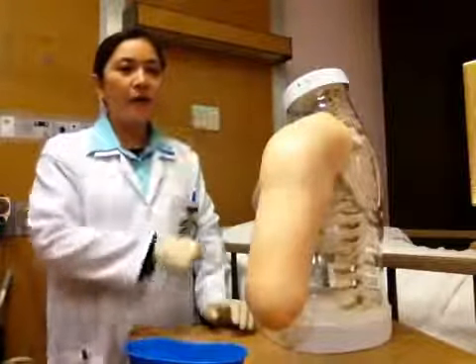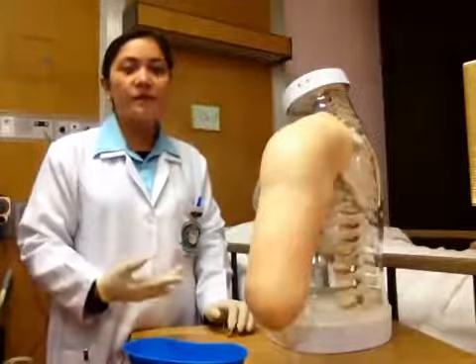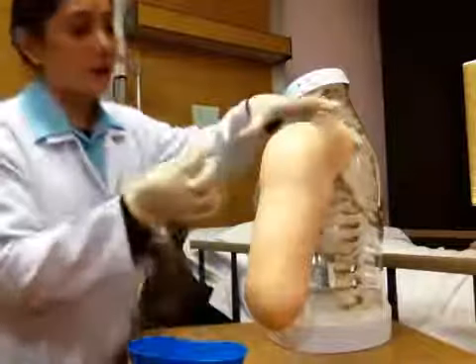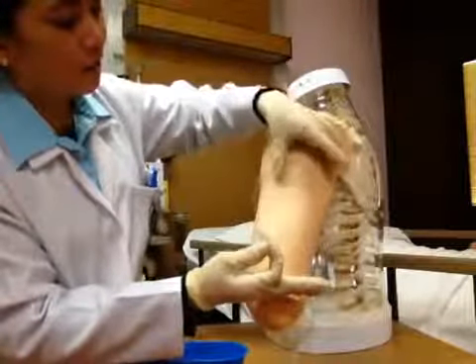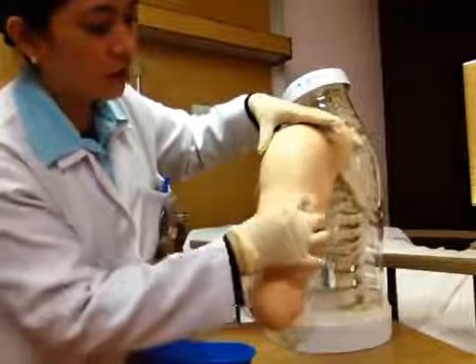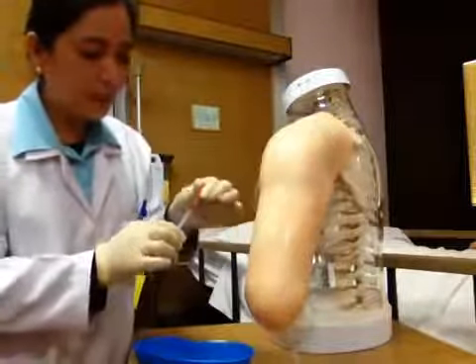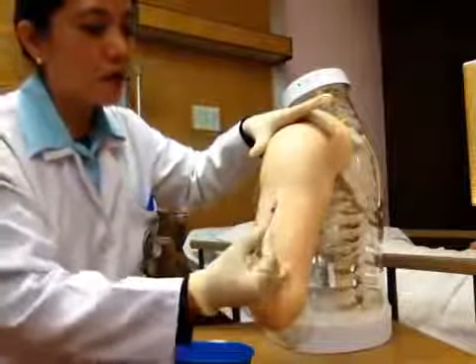So in a rotating manner, we can alternately give this injection to our patient if she is regularly receiving subcutaneous injections like insulin. The same thing, we have to cleanse or prep the injection site. The correct location of our injection site is the upper two-thirds of the lateral side of the arm, which we're going to do here. In a rotating and circular manner, cleanse or prep the area, about 1 to 2 inches in diameter.